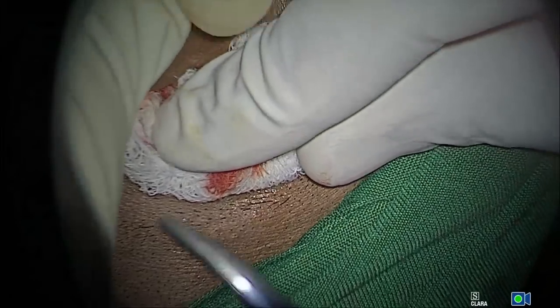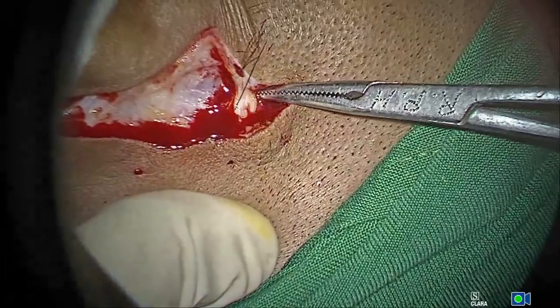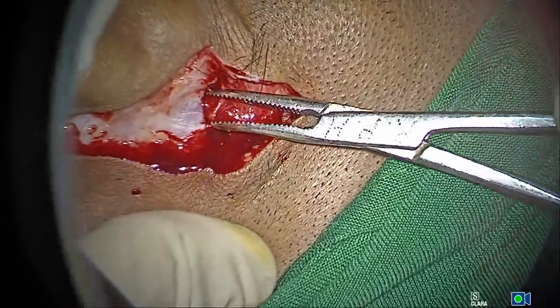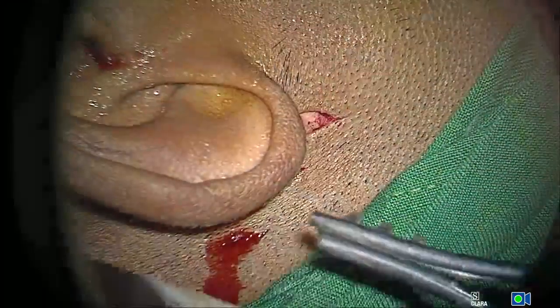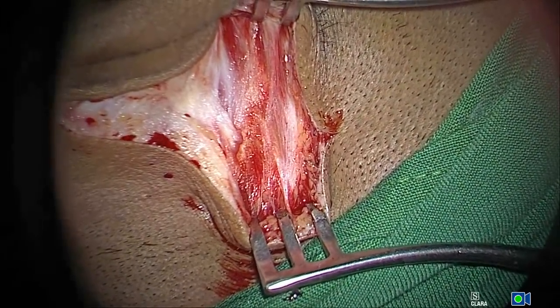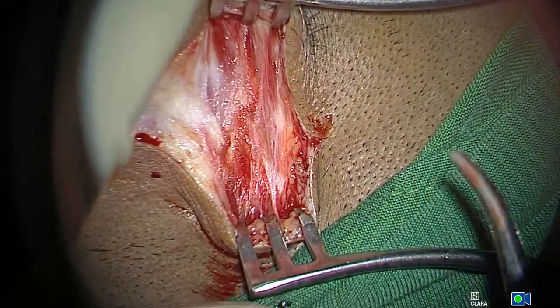Then the next step, so I divide into steps. As you know, all my surgeries are divided into steps. The second step is using the artery forceps directed downwards, and I separate the tissues. Third step is using a retractor. I put that retractor there. See how nicely the field is seen. I hope it's seen very clearly, Chaitra.